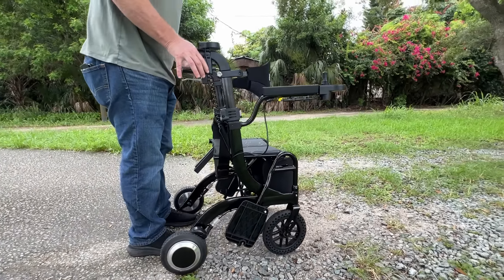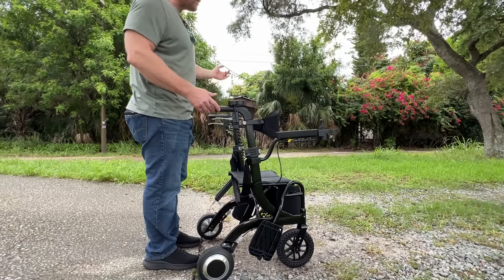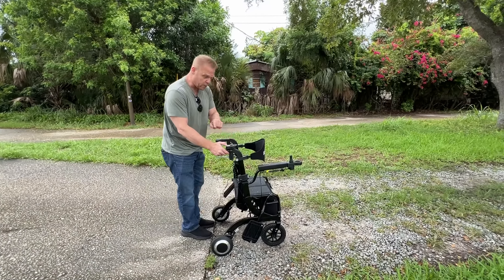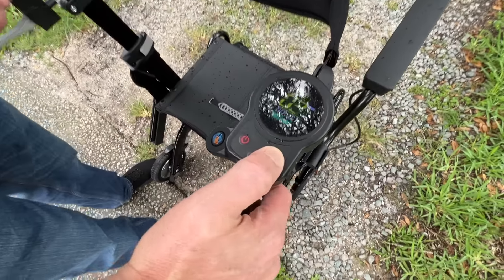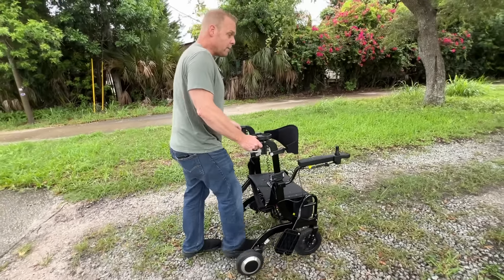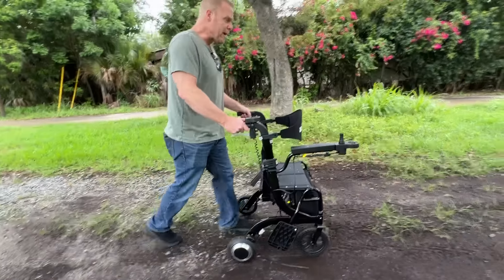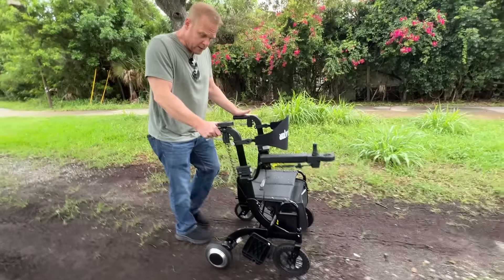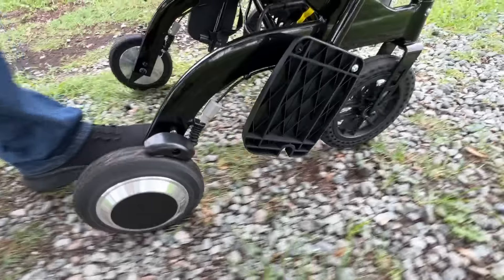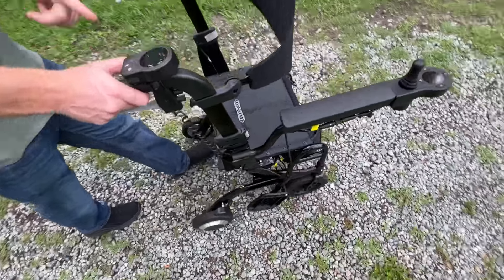Now I'm kind of down to the bottom of this hill and the terrain is a lot different here — I've got some gravel, some grass, some dirt. I really don't want to go through the mud, but I want to ultimately get to that walking path. So I'm going to go to the back joystick and filter it to C1. I'm going to press this thumb down — this is actually providing motorized support. I can go to C2 or C3 to go faster, but right now I feel this is a good speed. I'm going through some dirt, it's drizzling, and I'm not really working to do this — I'm just pressing my thumb down on that button.